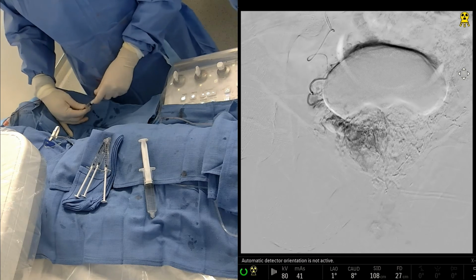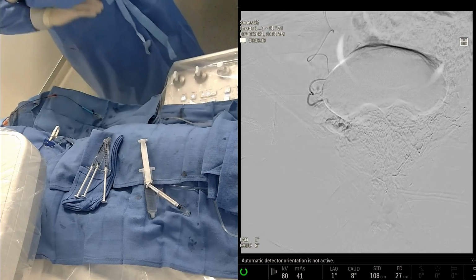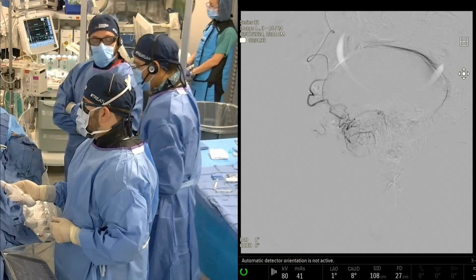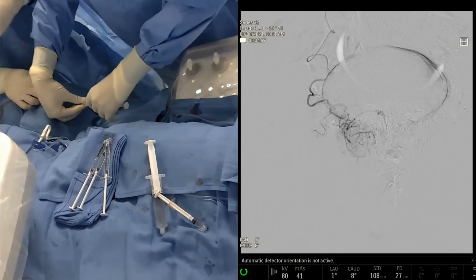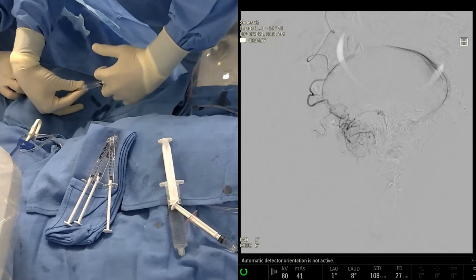Beautiful. This is obviously the majority of his prostate in the middle lobe here. So we're going to show you how we do this differently without the balloon. So let's do that now. This is D5. We're going to do D5 first. The technique is a little bit faster. You can see there's a collateral going to the other side of the prostate too, which is nice.